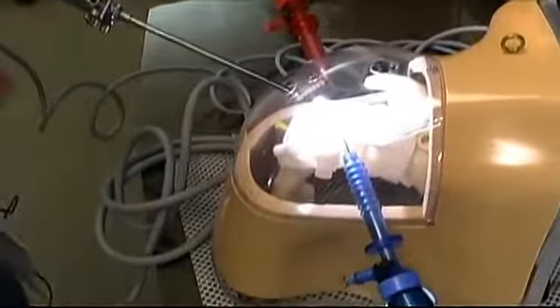So when we would need to penetrate the cuff to sew it back down to the bone, we can practice by using this instrument here to help penetrate and sew the tissue back down to the bone. Now, the steps that we do here in the classroom are identical to the steps that we use in the operating room. It's better to practice on a model than it is in the operating room. Get the steps perfect, get the technique perfect, get the idea perfect, and then anything else that happens to come up at the time of surgery, we manage.